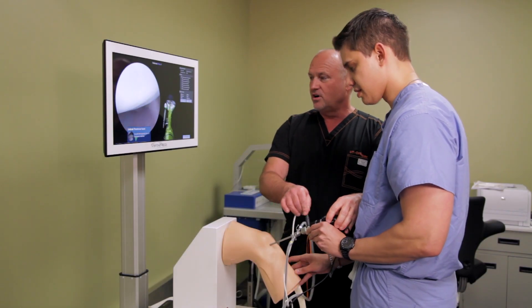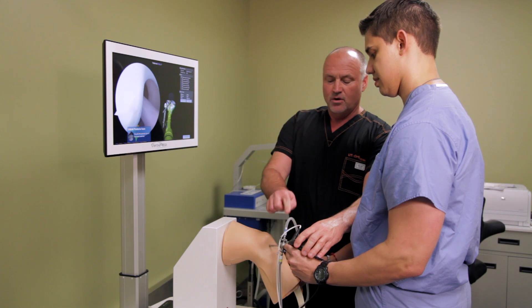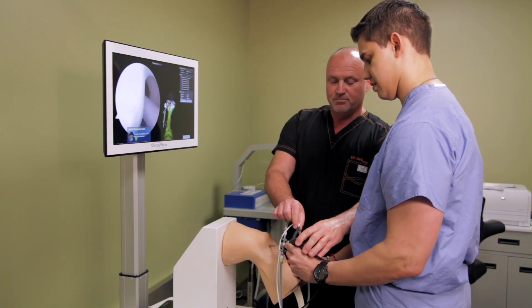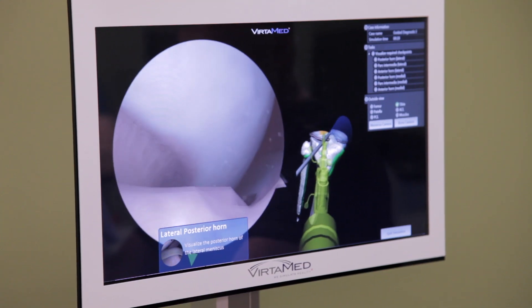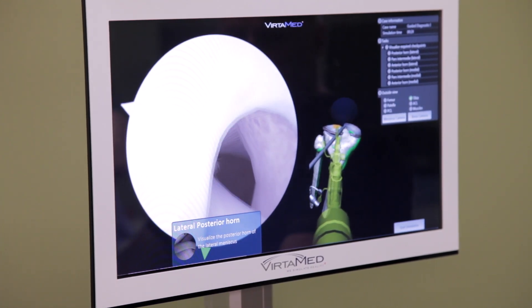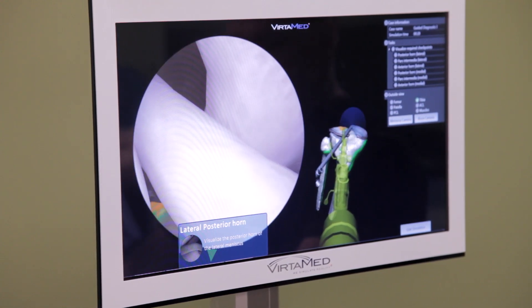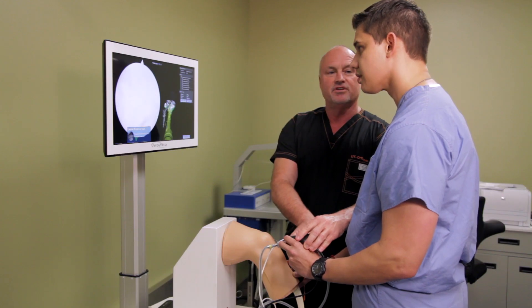The way arthroscopy works is we always want to view looking lateral, and then when this objective turns, we're looking 30 degrees away from wherever that is. So we're looking 30 degrees to your left, 30 degrees to your right, 30 degrees down, 30 degrees up.